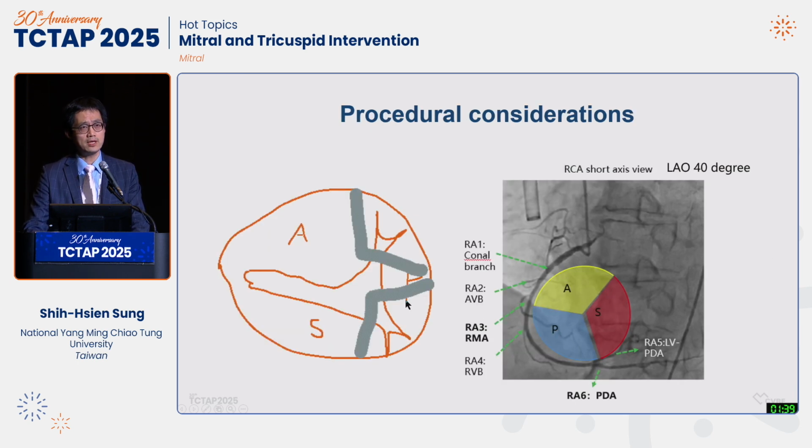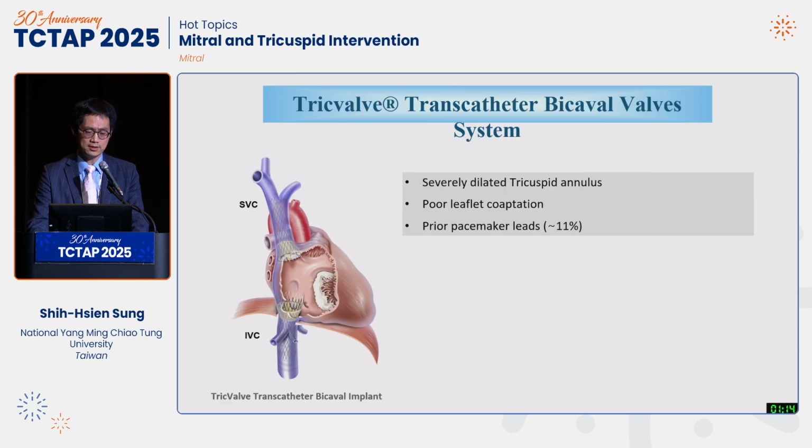And if the patient has a really torrential TR, a really huge tricuspid annulus, you can also have a modified procedure, a two K-Clip procedure, to shorten the AP and also the septal-posterior. And if you leave an anterior-septal regurgitation, you can also combine with the TEER technology. Of course, again, you have to watch out for the right coronary artery flow during the whole procedure.